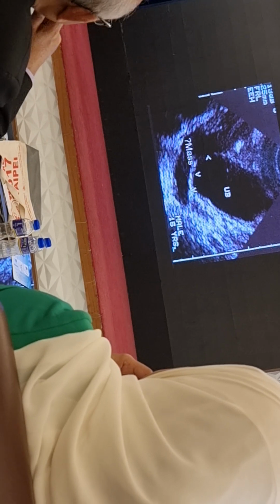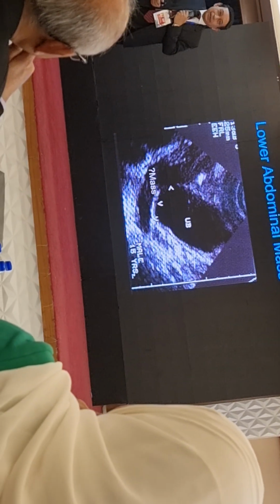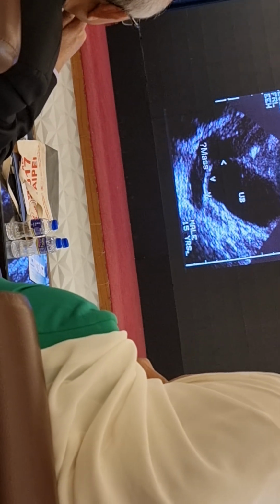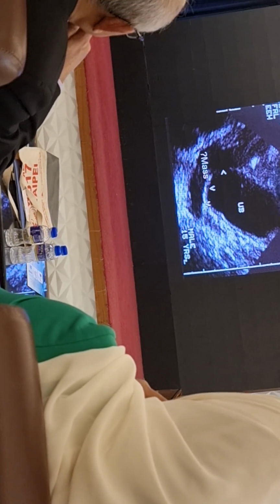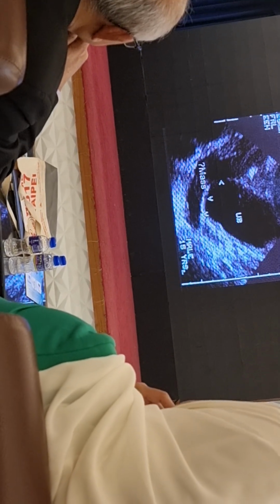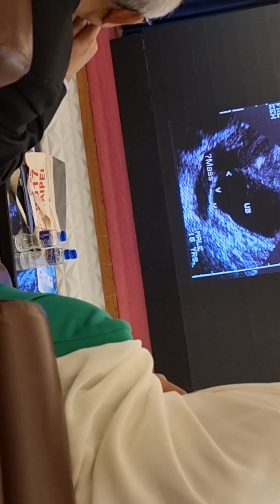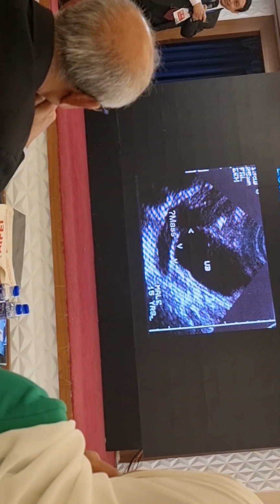What is it? This is a patient. Of course, this is a male patient, 15 years. This is the urinary bladder, and at the back of the urinary bladder, there is a very big mixed echo mass. Then I became a bit confused. If it were not male, if it were female, then I could say there may be some ovary or ovary related problem. But because he is male, what is it? But then the patient started feeling discomfort. Then I asked him, what is the problem? He said, "Sir, diarrhea since last night." So what is it? Rectum. Yes, this is rectum, full of stool.